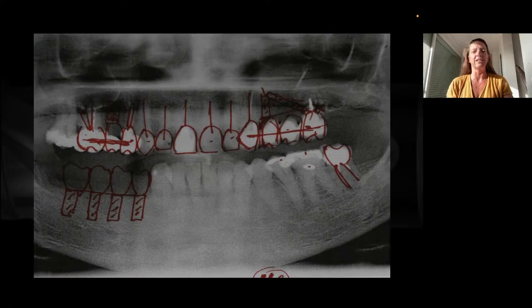This is a clinical case that a patient came to me many years ago. This is basically the OPG, and this is how I show the patient how the planning is. So we can see that we had here lack of teeth in the sixth sextant of the patient, and it was a very thin ridge. So in this case, we planned for 4 implants, okay?